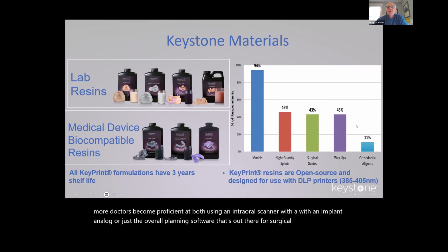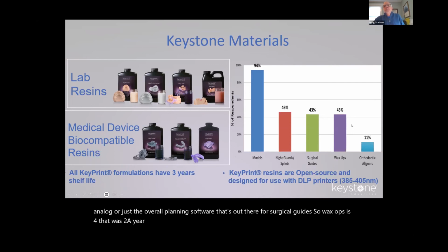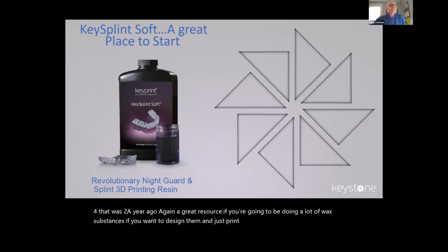So wax-ups are number 4. That was number 2 a year ago. Again, a great resource if you're going to be doing a lot of wax-ups. This is if you want to design them and just print them. It's a much more efficient way to do it.